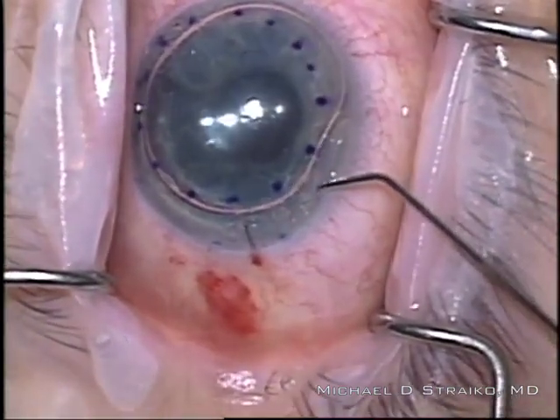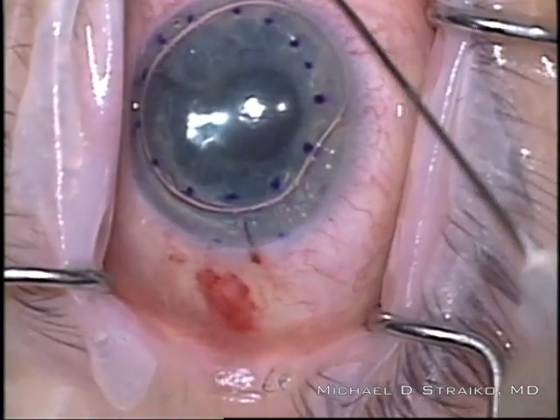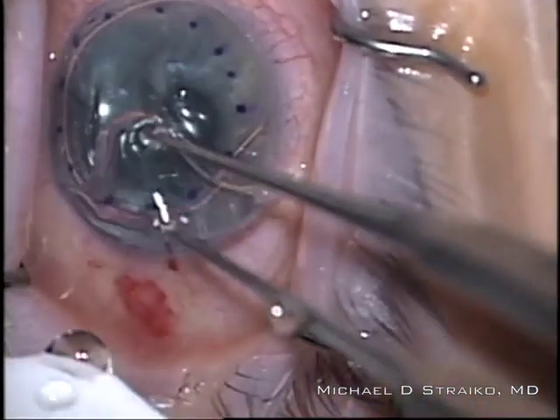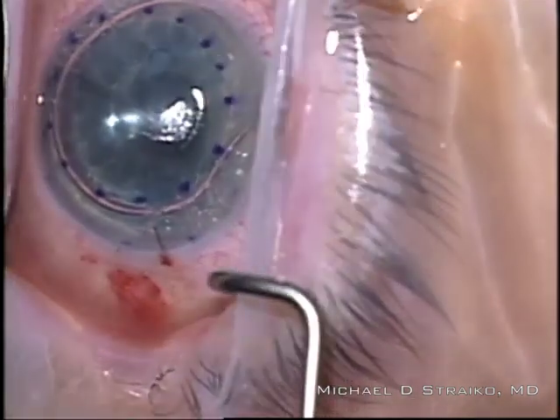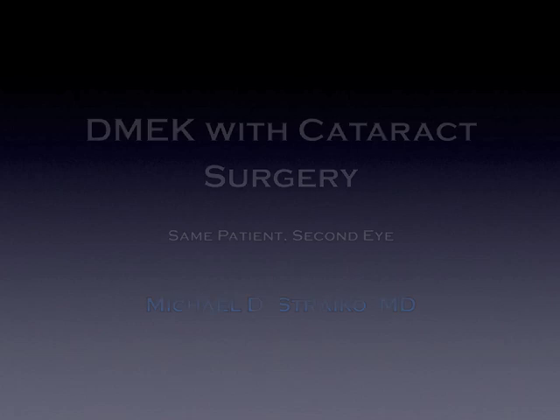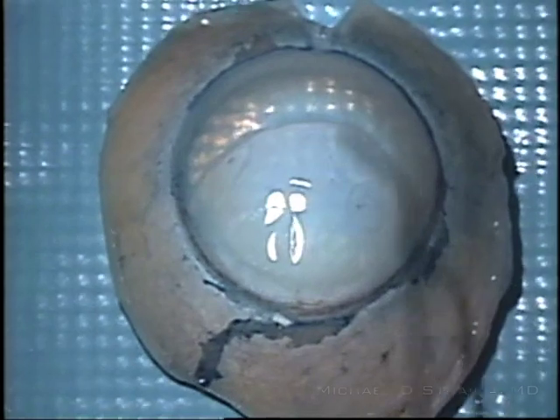I'm very careful with the pressure at the end of the case to make sure it's not too high. I put a collagen shield on that's been soaked in antibiotics and steroid, then remove the speculum. I do patch and shield overnight — I don't need to see the patient again until tomorrow morning. Now I'm going to show you the same patient but it's her second eye — the right eye this time.